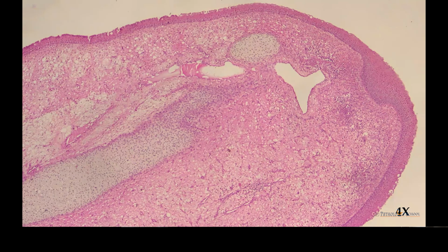Coming to a brief and quick discussion, in our case the clinical presentation and radiology both pointed towards malignancy. But when we saw the histology picture, it was very diagnostic and quite obvious that we were dealing with a case of sinonasal hamartoma. Our slides showed a mixed component, that is, a mesenchymal cellular element comprising proliferating spindle cells and nodules of cartilage showing various levels of maturation. Looking at the cartilage, we thought of two differentials: a chondro-osseous and respiratory epithelial hamartoma, and a nasal chondromesenchymal hamartoma. But when we looked at the slides carefully, as in this image, we can see that the cartilage at the periphery shows a smooth transition towards proliferating spindle cells, and the other various mesenchymal elements are also seen in the background. So we offered the diagnosis of nasal chondromesenchymal hamartoma.